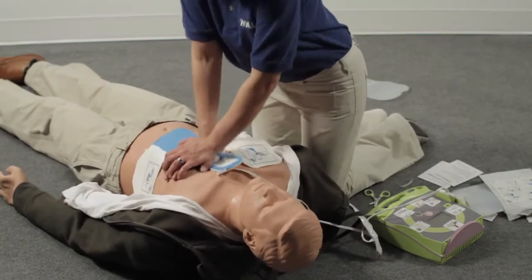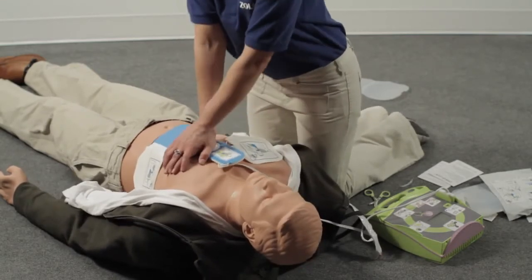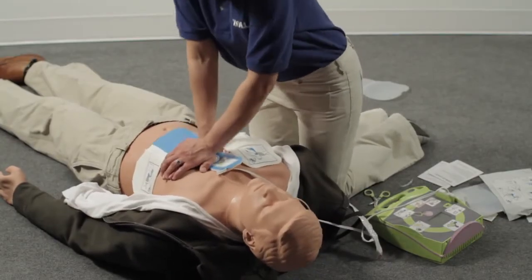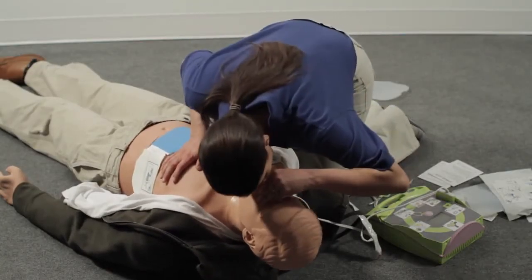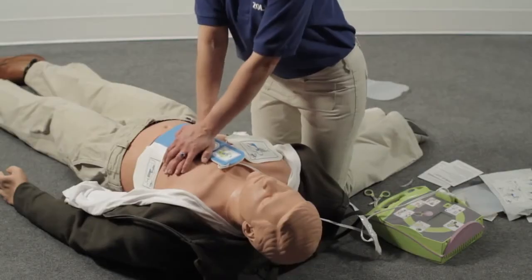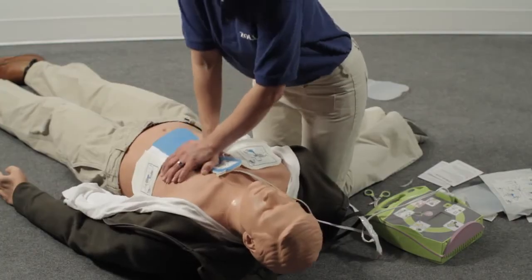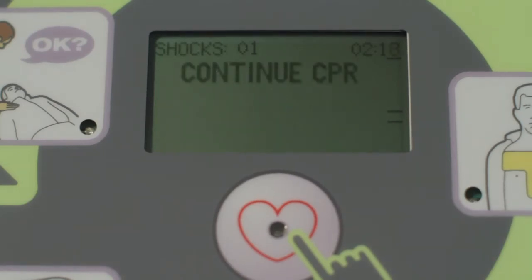Rescuers who lack the training or confidence to perform rescue breathing should perform continuous compressions without stopping. Compress the chest hard and fast 30 times, then give 2 breaths. After 2 minutes, you will have completed about 5 full cycles of 30 compressions and 2 breaths. If you don't start CPR right after being told to do so, you will be prompted every 10 seconds until you do. If you stop for longer than 10 seconds, the AED Plus will tell you to continue CPR every 10 seconds until you resume.